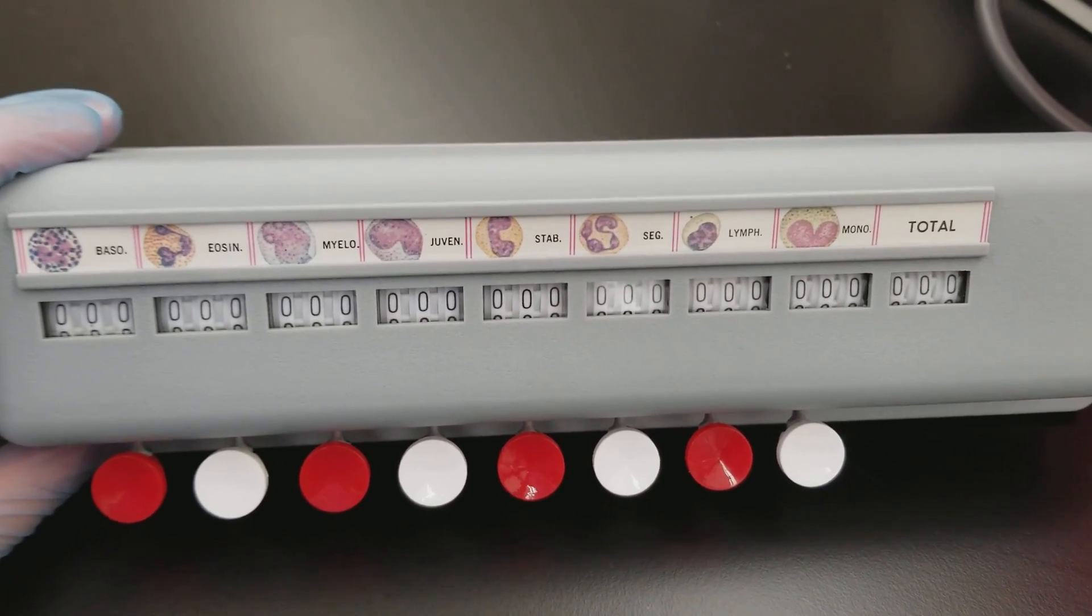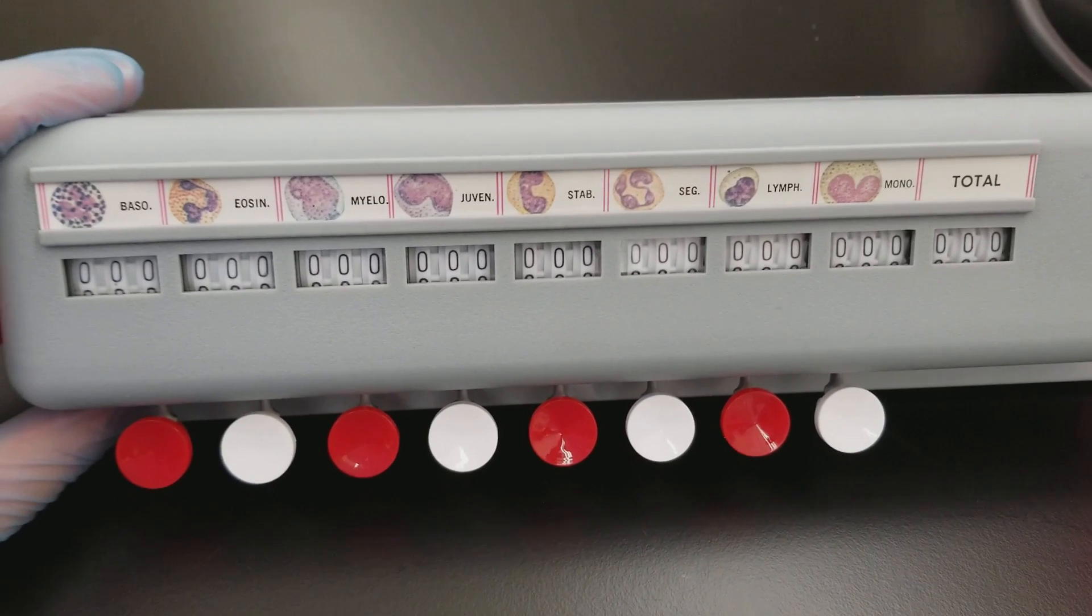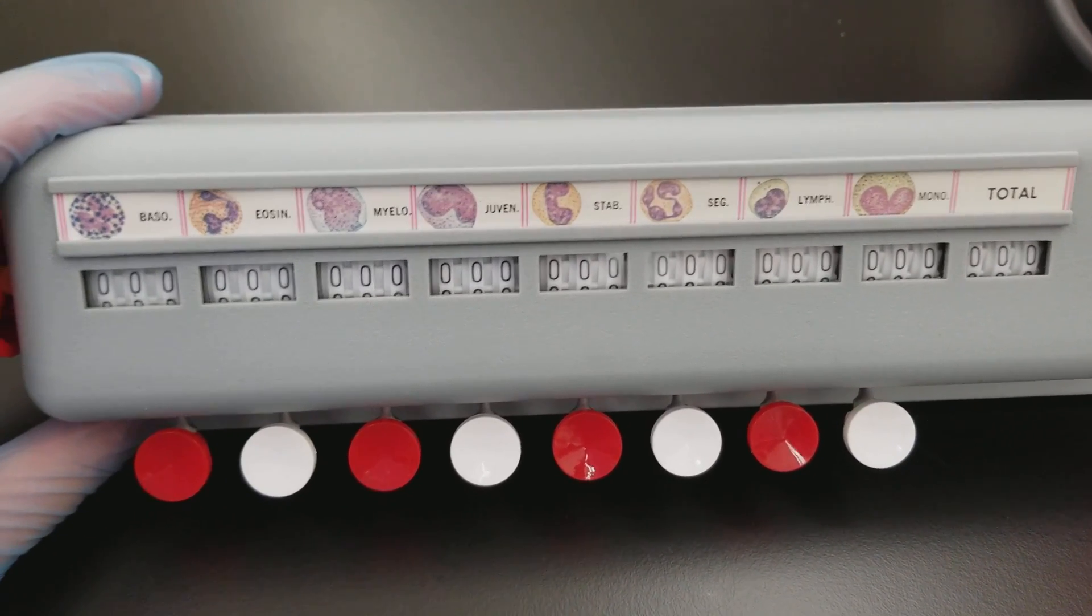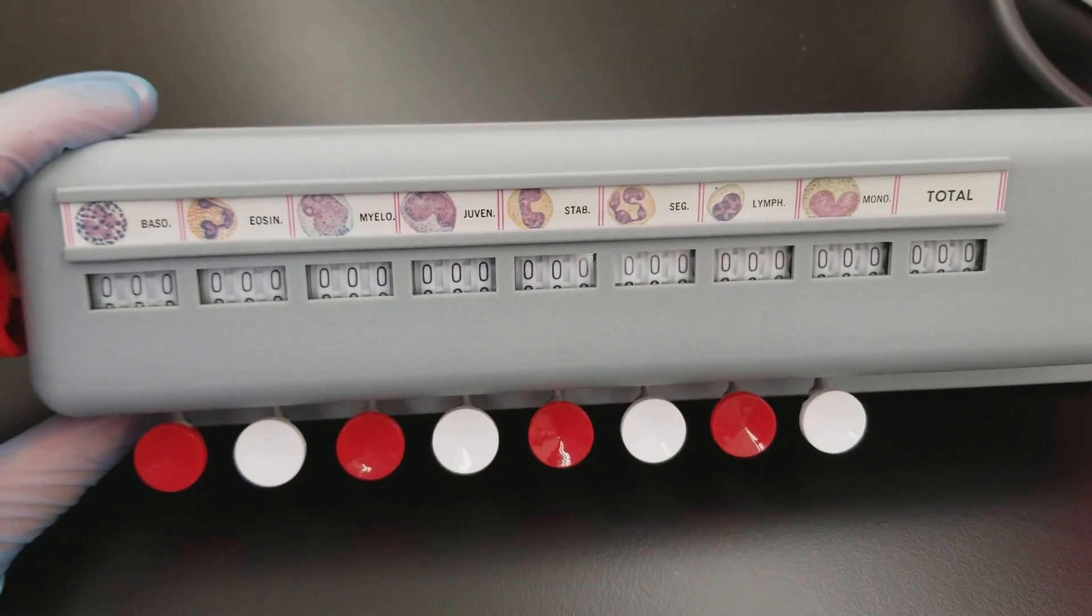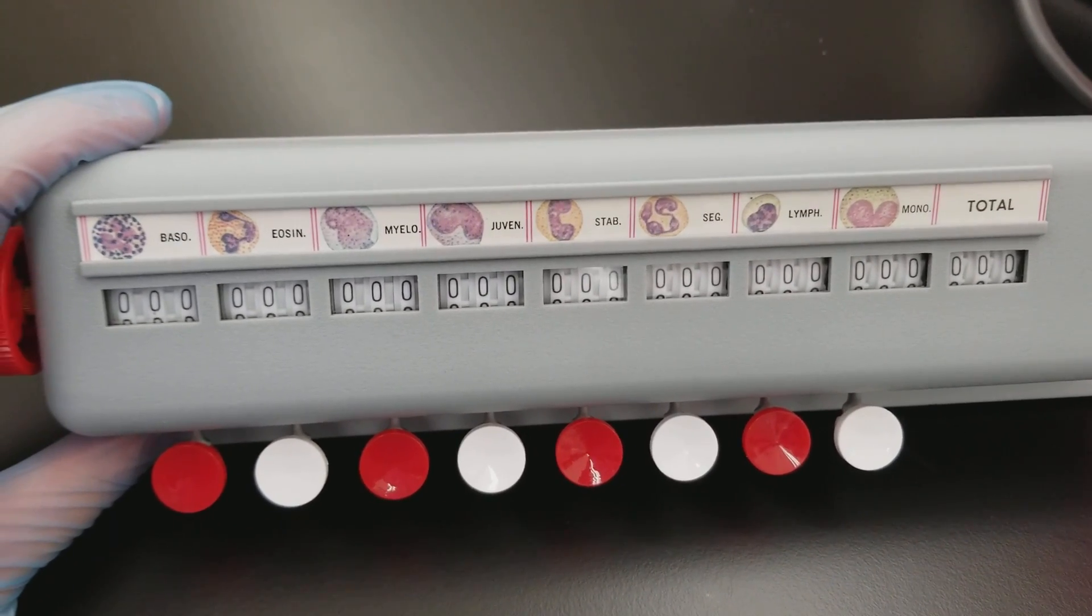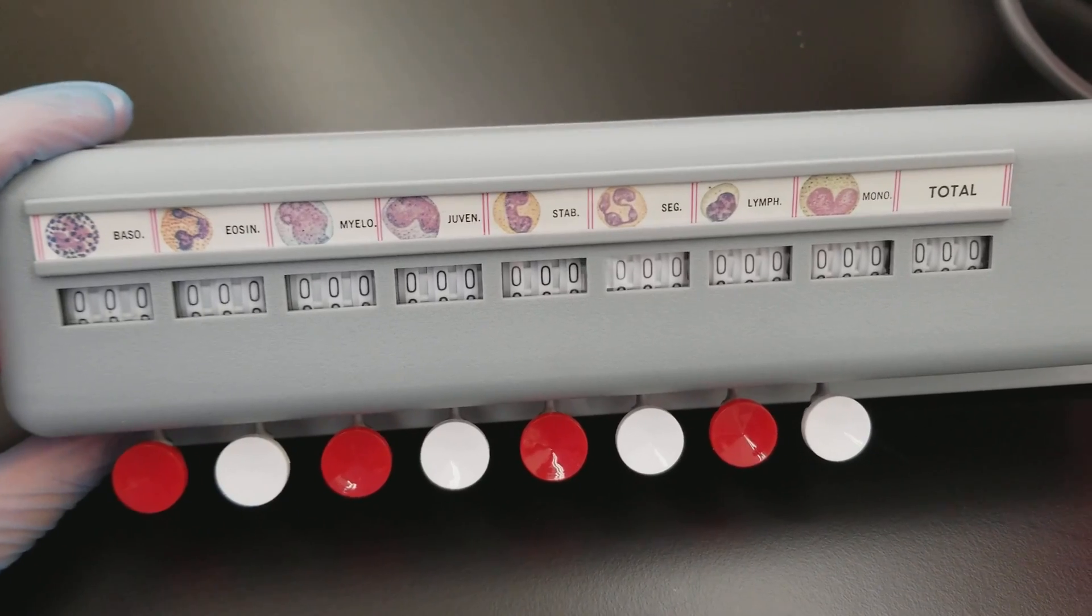The red cells look good in regard to their actual morphology. So you just want to make sure that you scan everything first to see if there are clumps and immature white cells that maybe you may not see in the thin area.